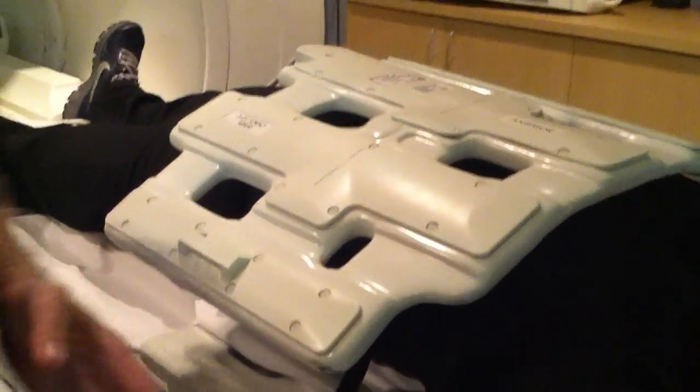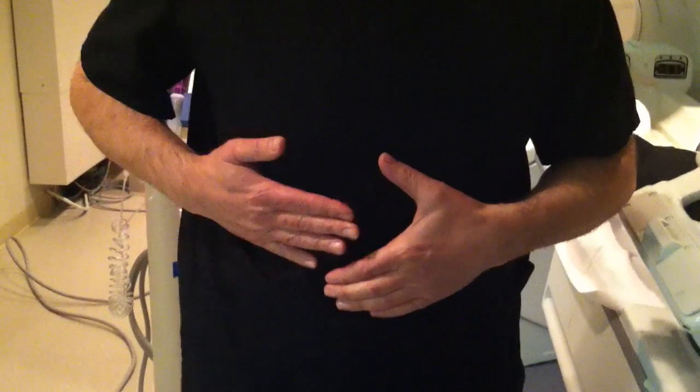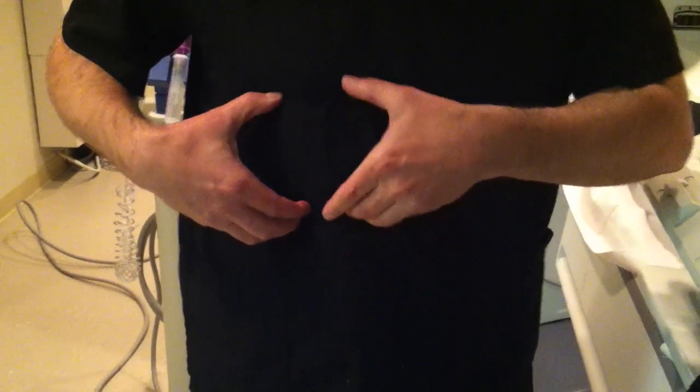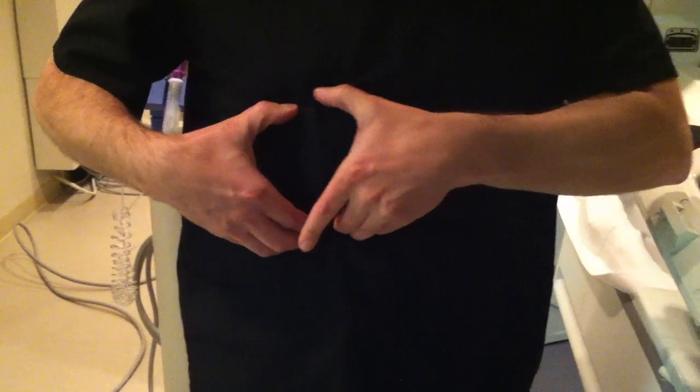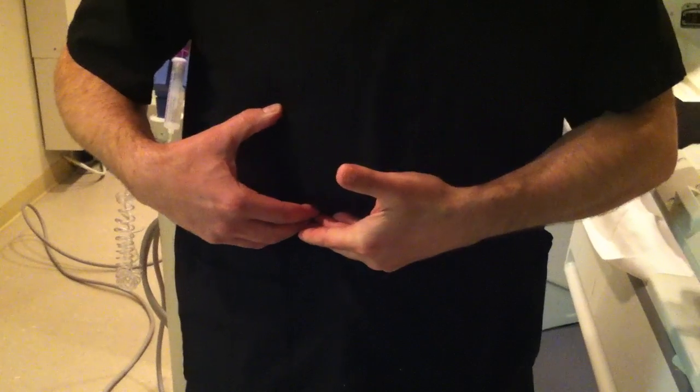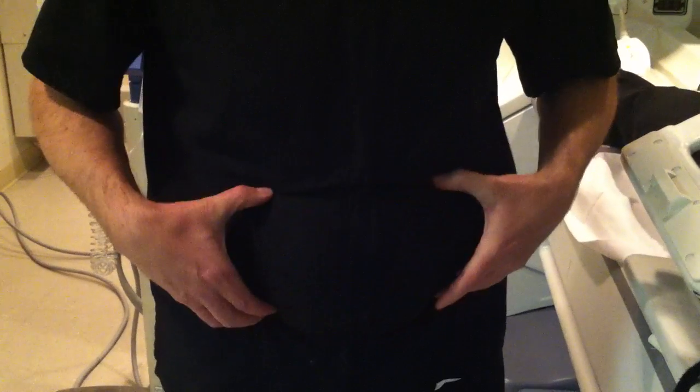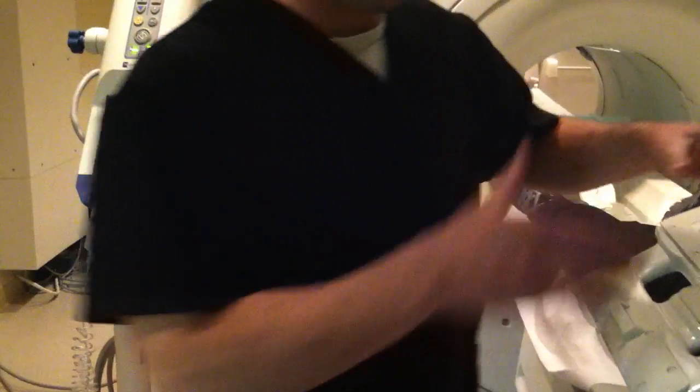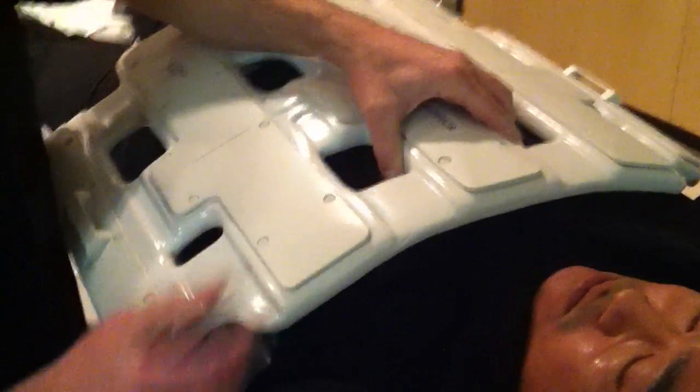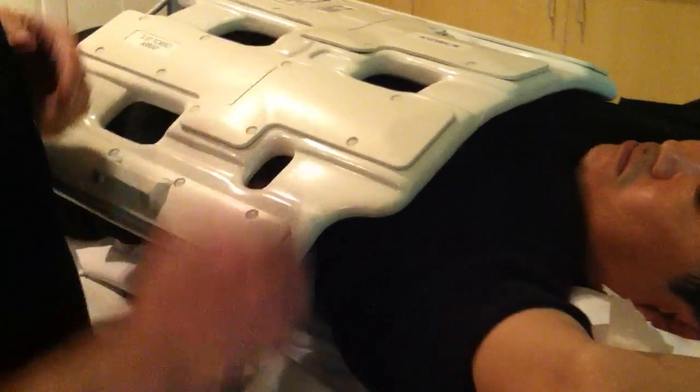The liver is not in the stomach. The liver is under the ribs. It's on the patient's right hand side under the ribs. It covers an area from about where the nipple is to the bottom of the rib cage. And you'll notice it's here. It's not in the stomach. It's up where the chest is. So on our patient, the nipple line is here. That means the liver sits right here. This is where we want the center of our coil to be or very close to it. Notice this is his stomach. We are not scanning his stomach. We're scanning the liver, which is up higher. So the coil needs to come to about where the armpit is. Very important.